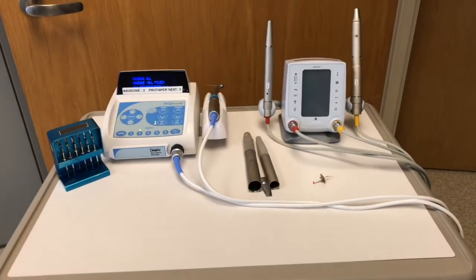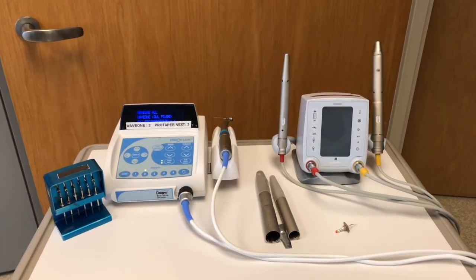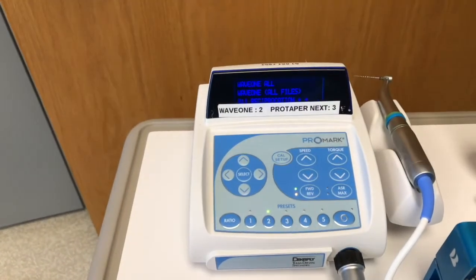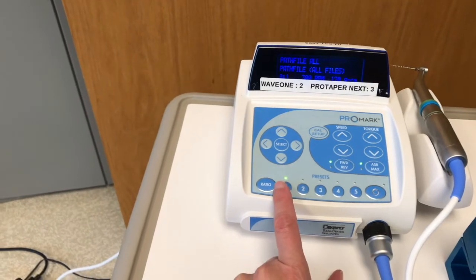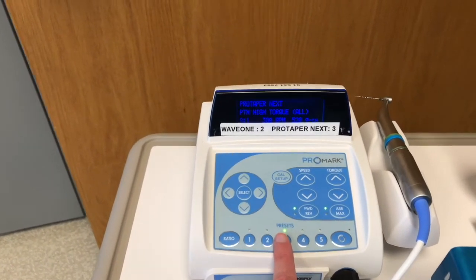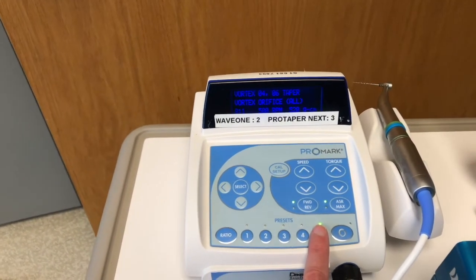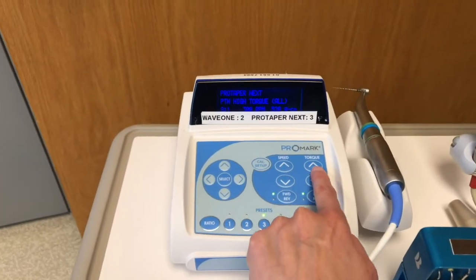The other piece of equipment you're going to need set up — if you're using Wave One you're going to need your Promark motor. Then you have your Element system with different presets. Right now we're already in preset number two for Wave One. I can go up to preset number one — that's path files — preset number three is Pro Taper Next, then Pro Taper Universal, and then Vortex. If you want to go in and change your speed and torque, you can.